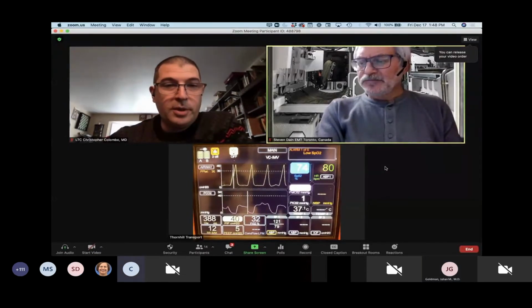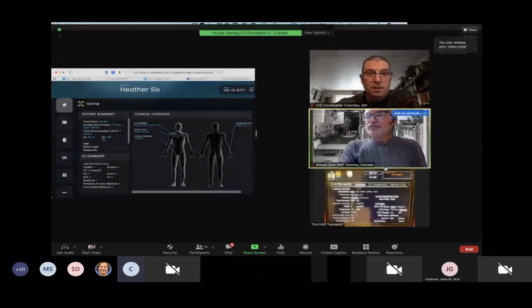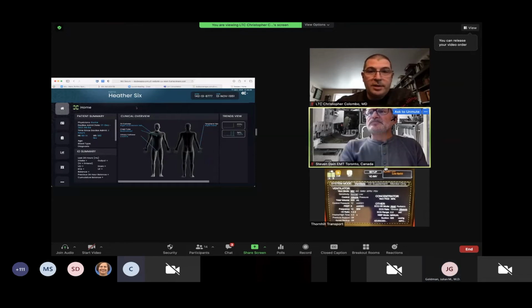No worries. So I'm going to go ahead, folks, and share my screen. You can see I've already logged into the DocBox environment. Dr. Dane, I just want to verify that this is patient Heather 6, date of birth 13 November 1951. That's correct. Okay.